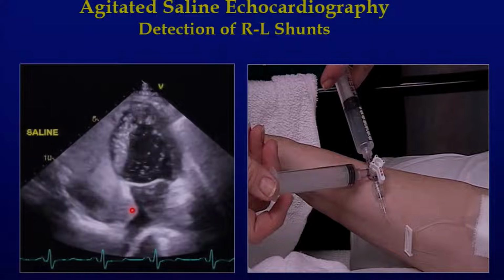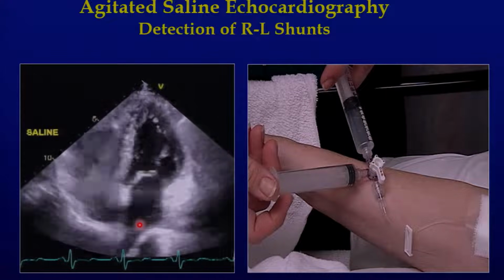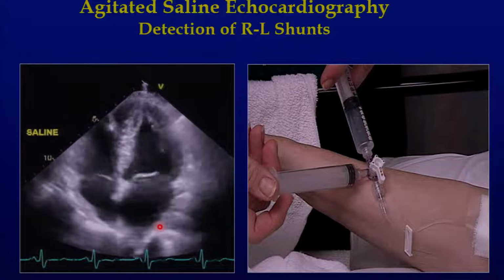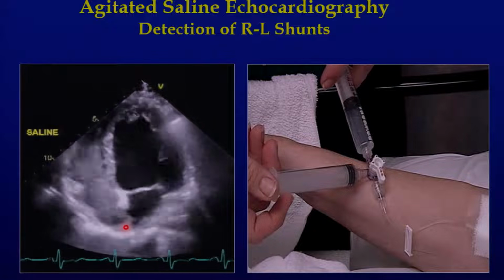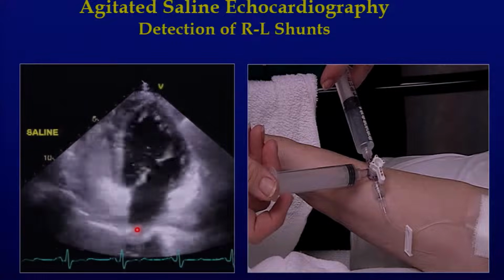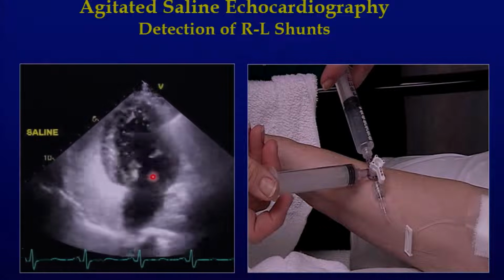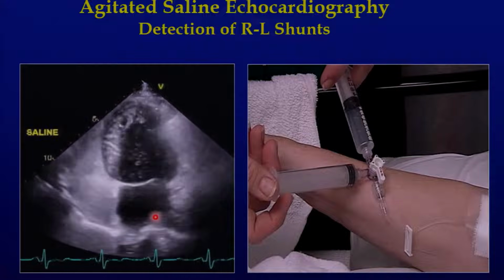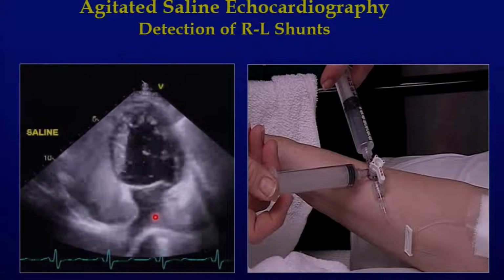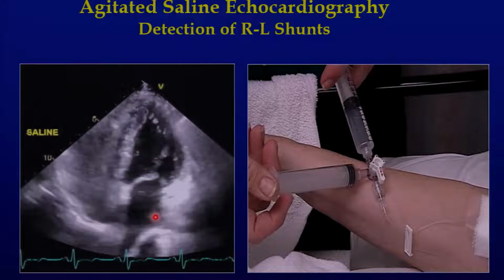However, notice in this beautiful case here that you have a patent foramen ovale with intermittent shunting, and you could see the interatrial septum bulging from time to time during respiration. You'll see a little puff of contrast coming on board, and then that puff goes away, as opposed to intrapulmonary shunting, where it starts a little later and continues to build on the left side.